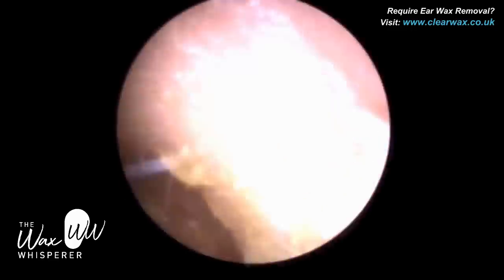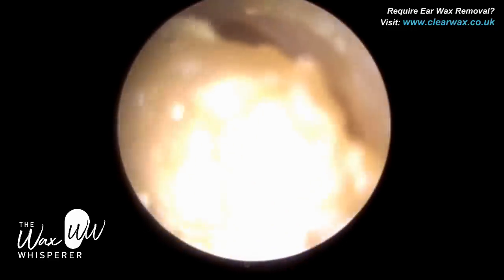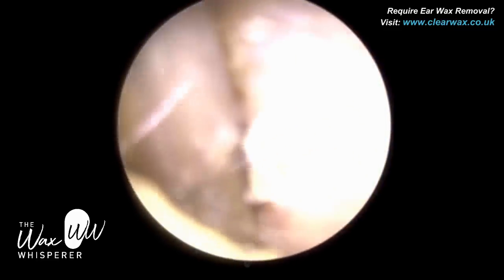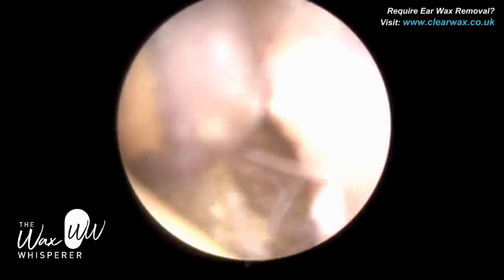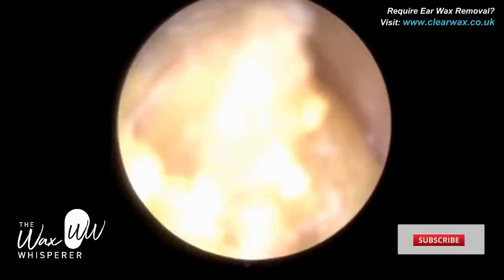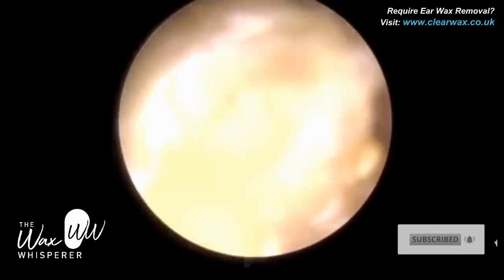Hi everyone, this is Mr. Neil Reiters here, also known as the Wax Whisperer. Thank you for tuning in to my latest video. The patient in this procedure attended with bilateral occluding earwax. The term bilateral refers to both ears. If it's just the one ear, we would call that unilateral.